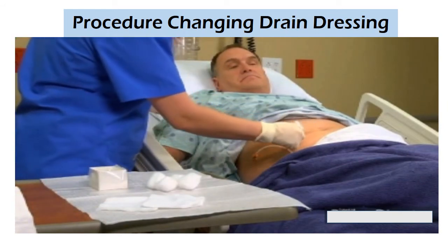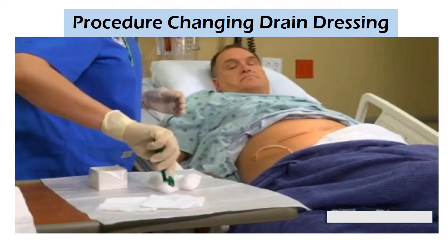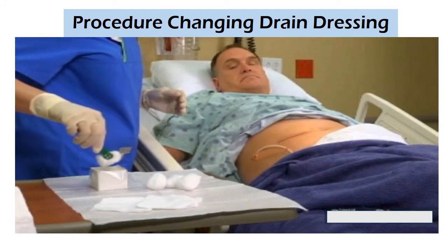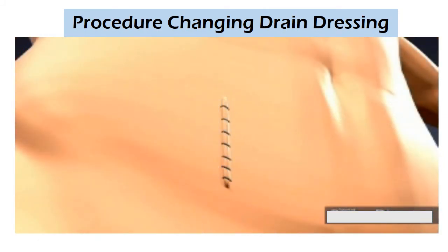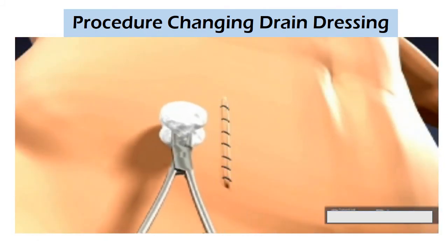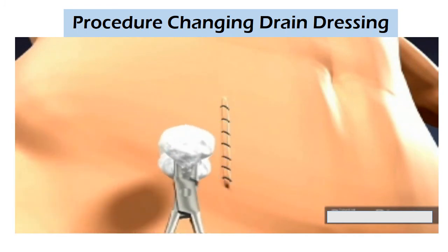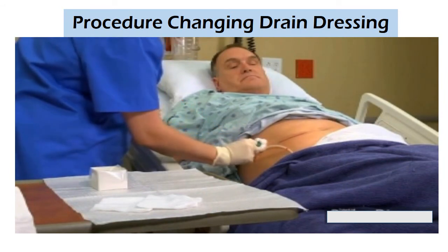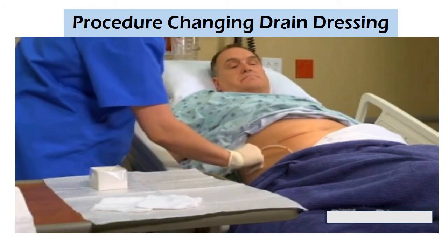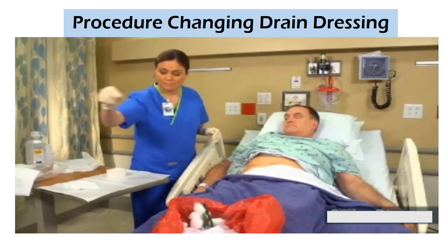If you use antiseptic swabs to cleanse the wound, use a new swab with every stroke, or simply spray the wound surface with antiseptic. As you cleanse the wound, work from the area of least contamination to the area of most contamination. If the patient has a drain, cleanse around it using circular strokes. Begin near the drain and move outward away from the insertion site.